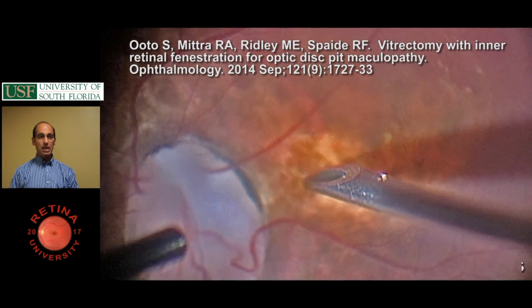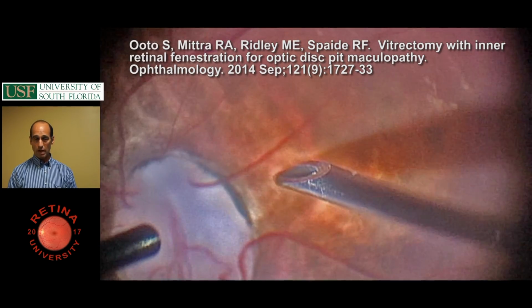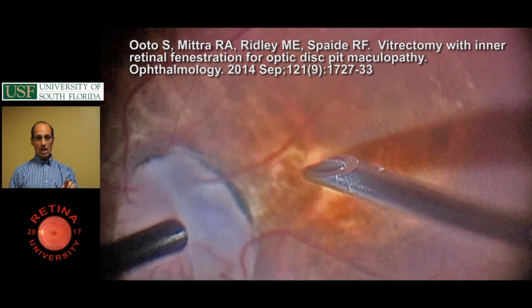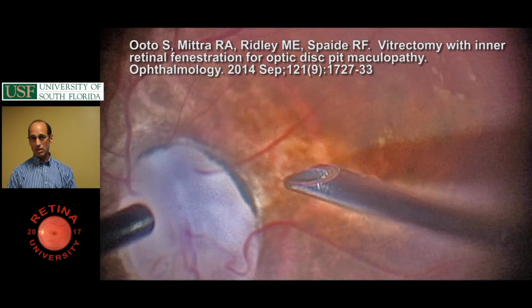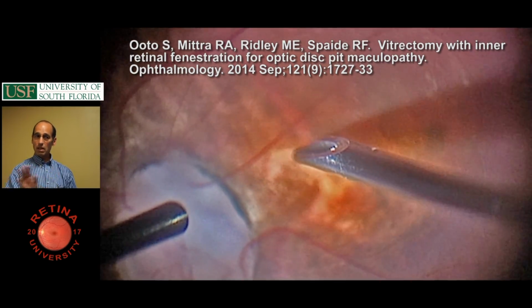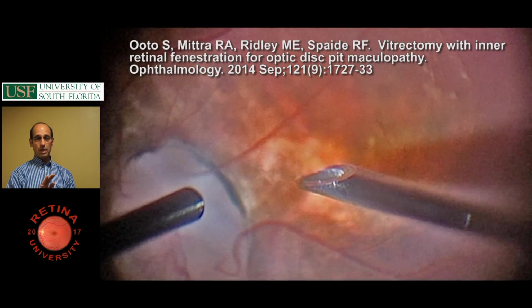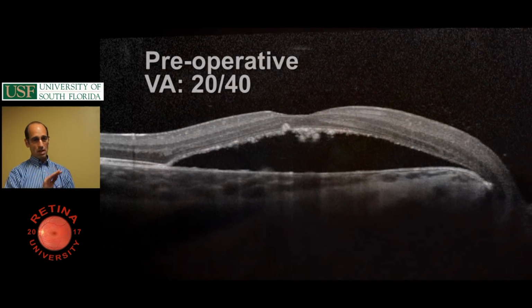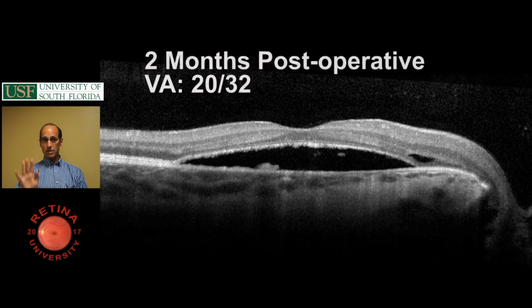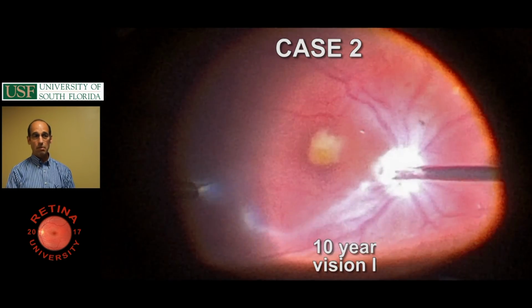And what we did in each case the same day was a vitrectomy and then an inner retinal fenestration. And what this is, you just take a 25 gauge needle. I didn't talk to the author, although I have been emailing him lately. And you just scrape the retina gently by the optic nerve. And the idea is that it creates a retinal defect that allows egress of subretinal fluid from under the retina into the vitreous. And it decompresses, and it worked beautifully.